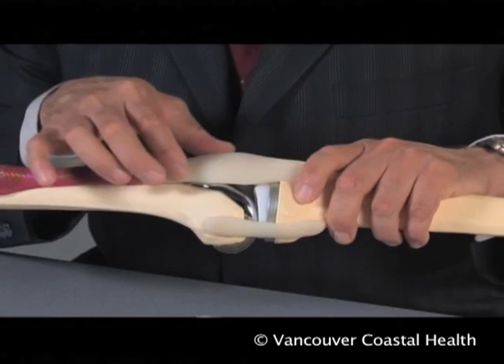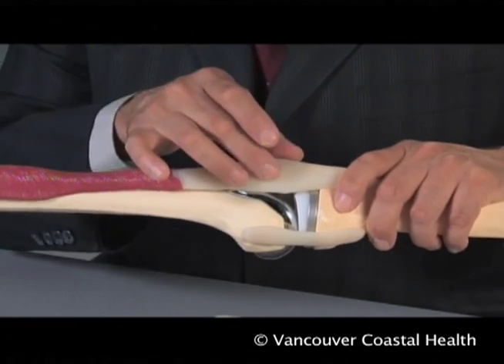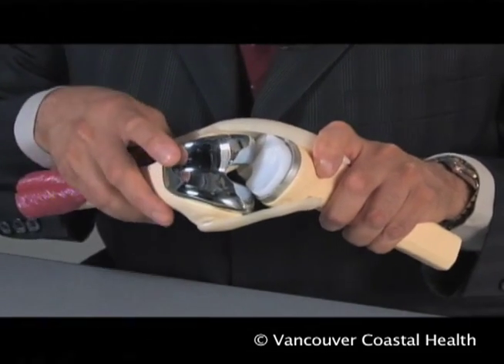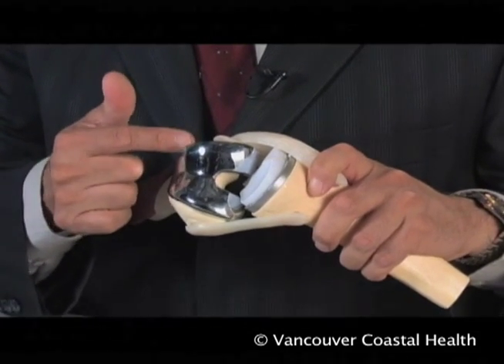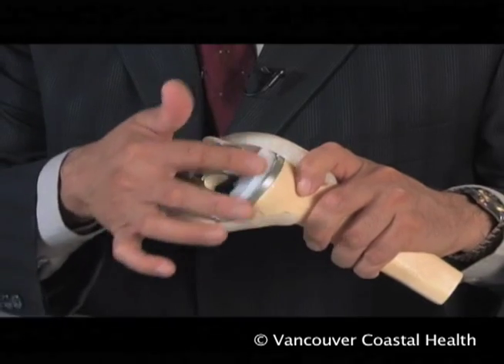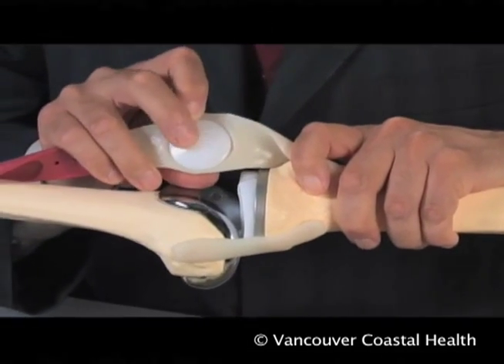A knee replacement is done by entering the knee joint through an incision through the tendon that attaches the quadriceps muscle to the kneecap, and then shifting the kneecap sideways, allowing the surgeon to enter into the knee joint to put in the femoral component on top of the femur, the tibial component on top of the tibia, and also a patellar component underneath the kneecap.